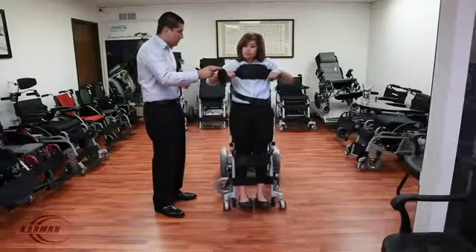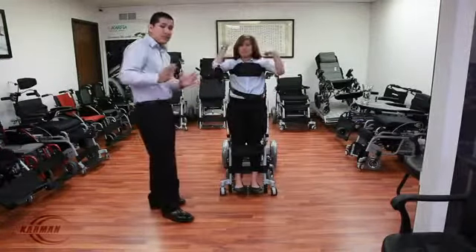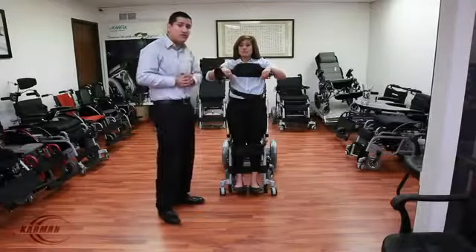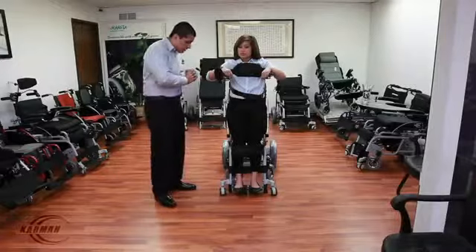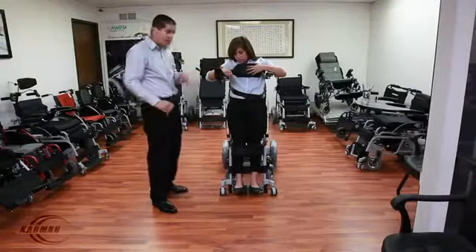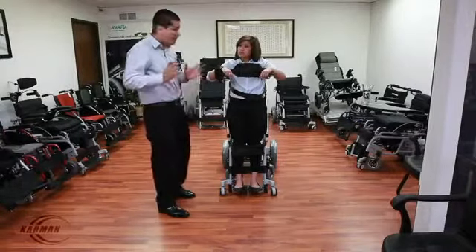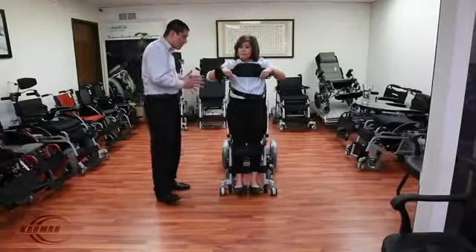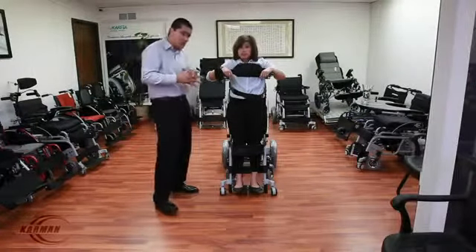We're going to demonstrate to you guys how safe this chair is. As I mentioned before, the fear of tipping over — the design of the front casters touching the floor is very safe. This ensures that the balance and weight of the user has been shifted to the rear, making sure the weight is not too forward, preventing you from falling.